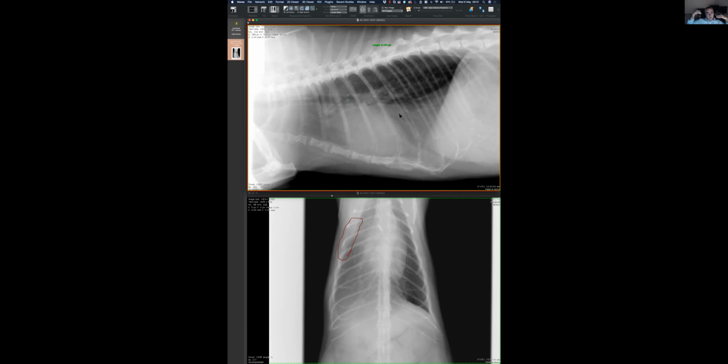So we got stuck in terms of the location. I argue against your comment that this is lung, because even though I think there is increased opacity, I think we can still see the lung vessels, and we don't see air bronchogram. So that is the argument against all of that opacity being within the lung. And then we are stuck with the idea of pleural disease, because one of the features here is behaving like an extrapleural sign, it's coming from the outside. But at the same time, if that is fluid, then we have a problem with being able to see the heart. And then we are left with mediastinum, which is hard to buy because that is clearly on the right hemithorax. So I think we are kind of stuck there.